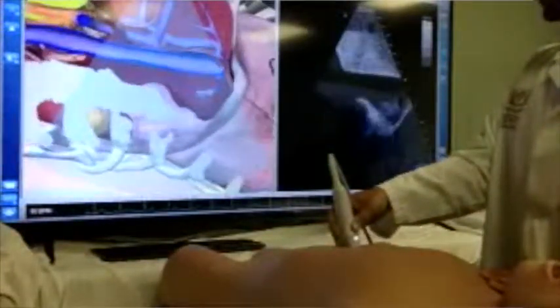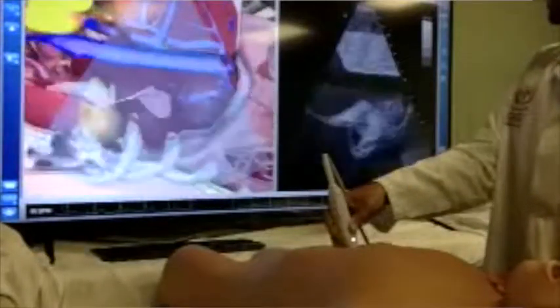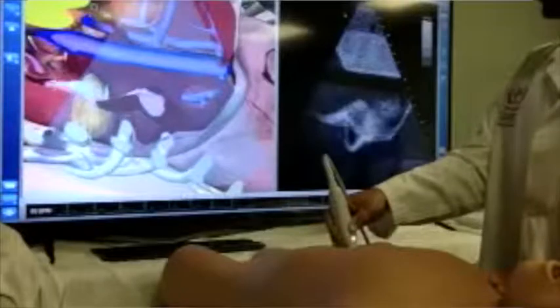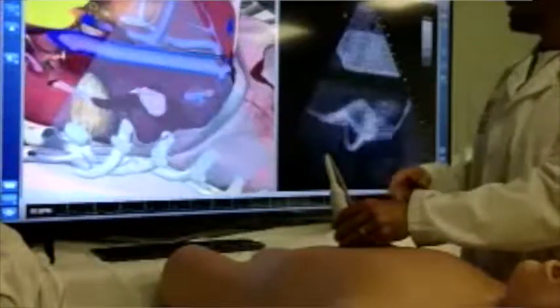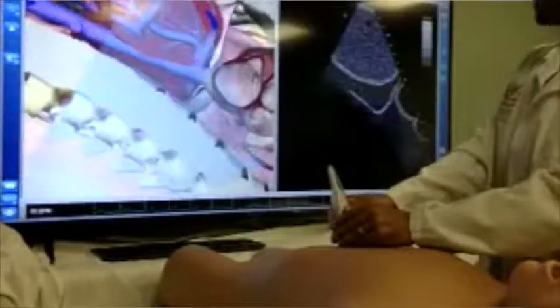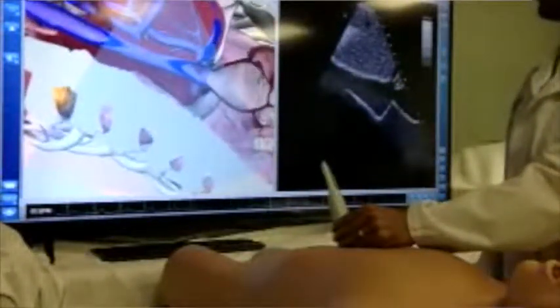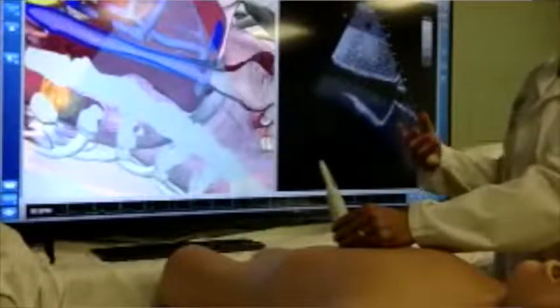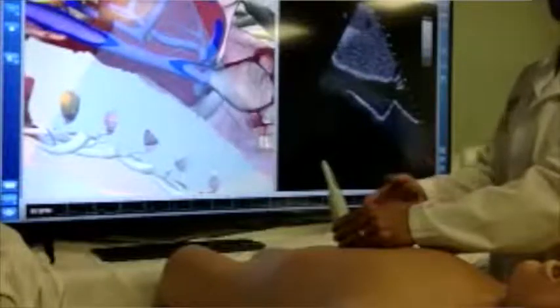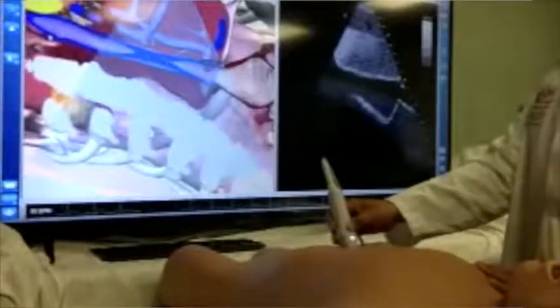With either technique, you're now evaluating for this other large vessel structure, and you see that it's integrated into the liver, and then you can also adjust your tilt to evaluate it as it goes into the right atrium itself. So it's always important to have that indicator identifying the abdominal aorta first, and then try to position the ultrasound plane more to the patient's right side to identify the IVC.